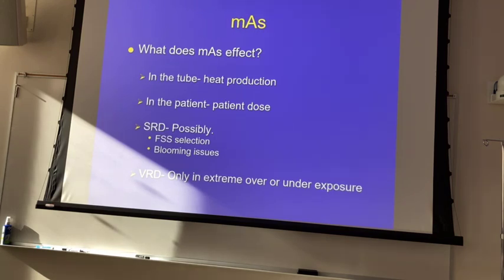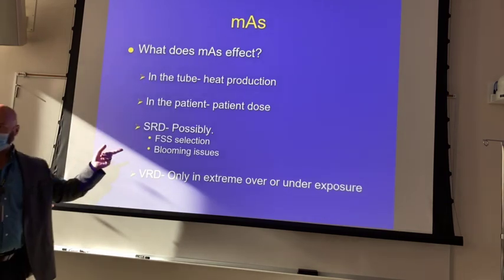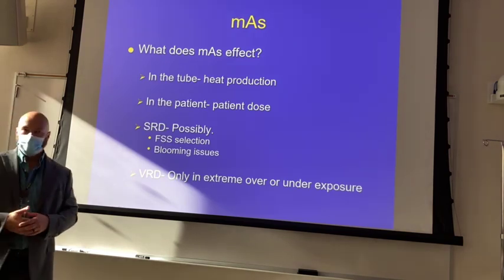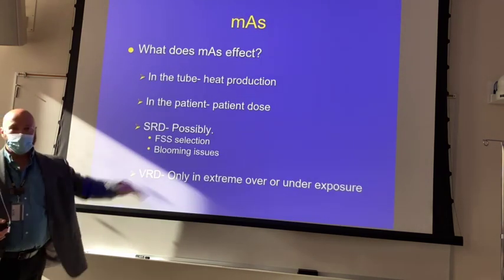It can have a possible effect on sharpness of recorded detail in two different ways, actually. One is just the seconds. If your exposure time is too long and the patient can't be still, you're going to have motion artifact. That's all about sharpness of recorded detail, right? It's the main thing that destroys your sharpness of recorded detail. You have some control over it, but your patient really has more control over it than you do. So it's not something that you can fully control. So seconds, that's one way, but the other way is blooming.